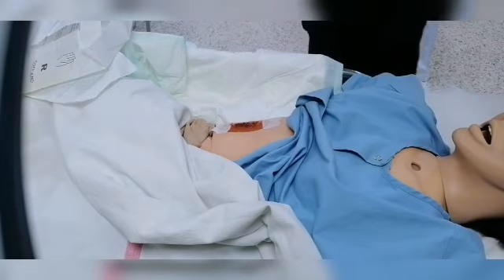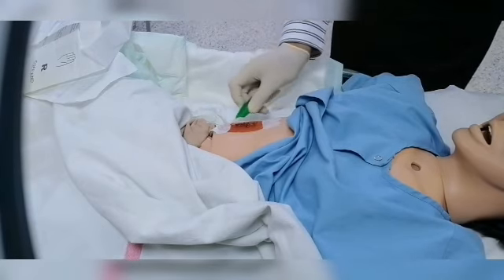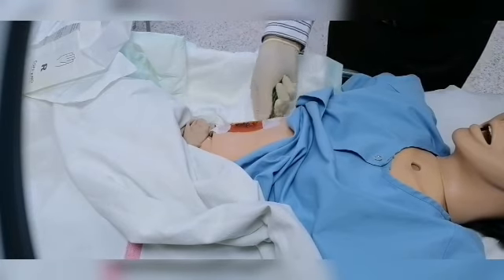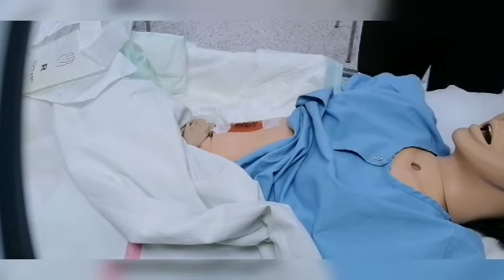If any fluid is coming out to the skin, I have to clean it properly, which is away from the skin. Then I have to dry it.